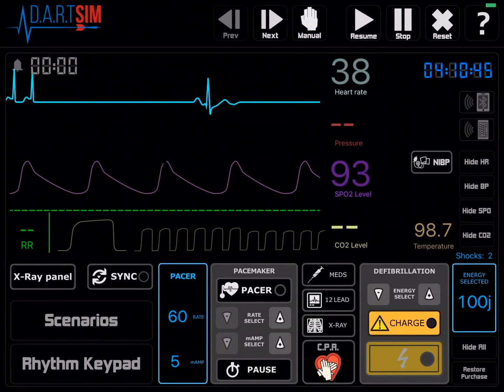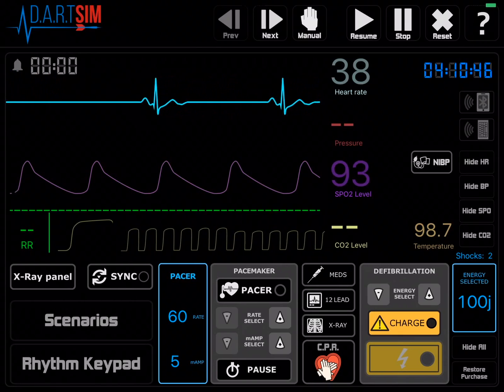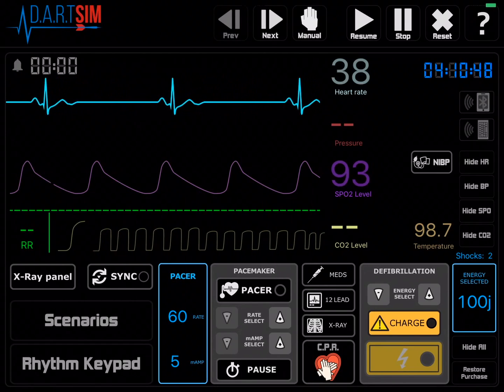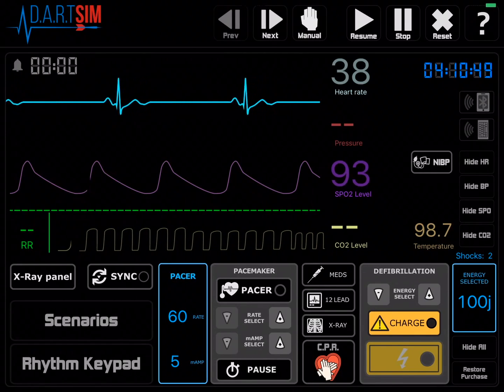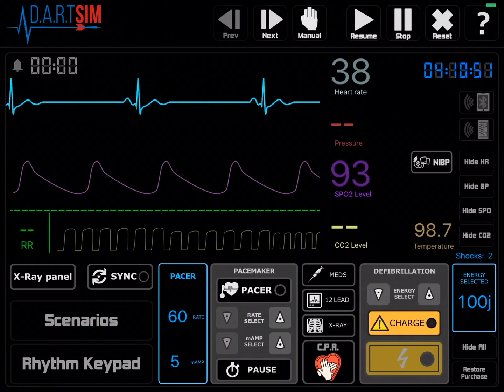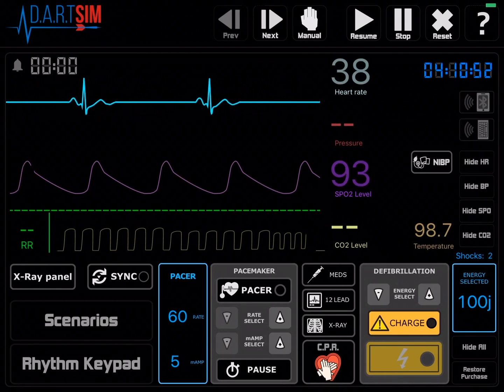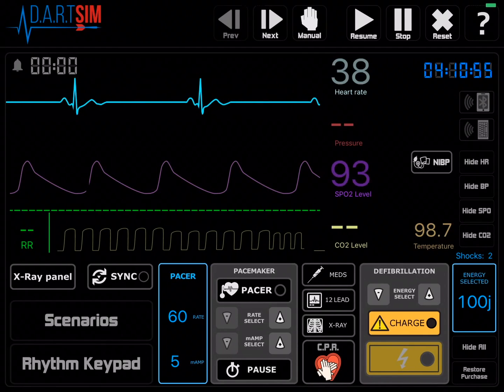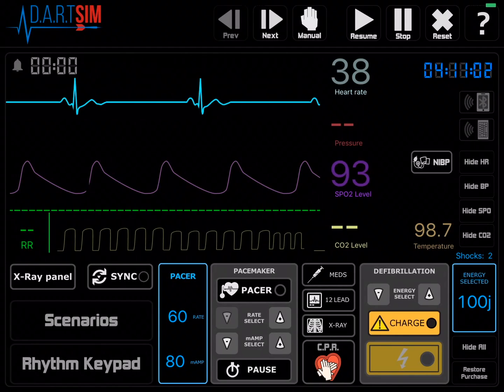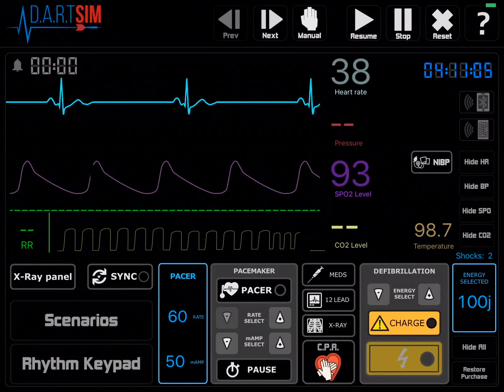If you have a slow rhythm that requires transcutaneous pacing, you can do that as well. You'll notice there is a pacemaker area in the center bottom area of the screen. You can select your energy there, as well as your starting rate, and then turn on the pacer.